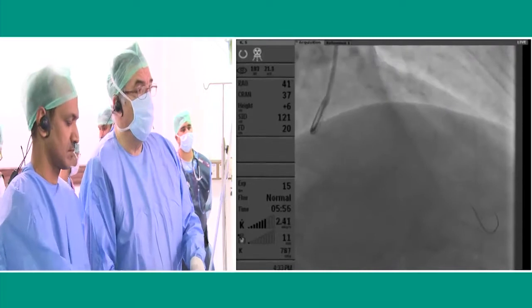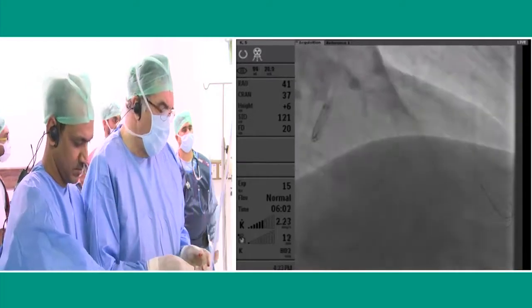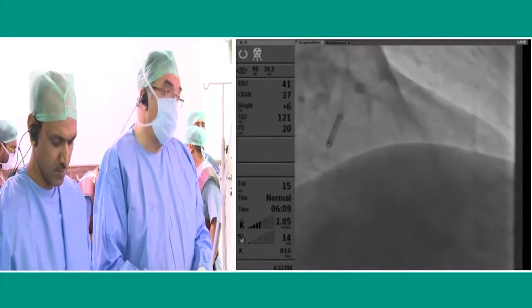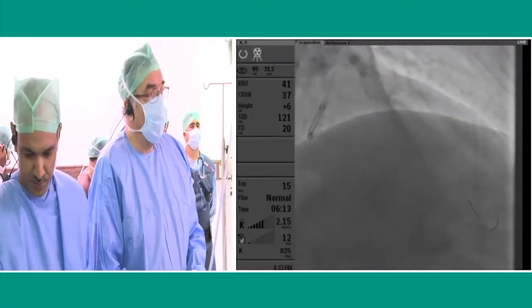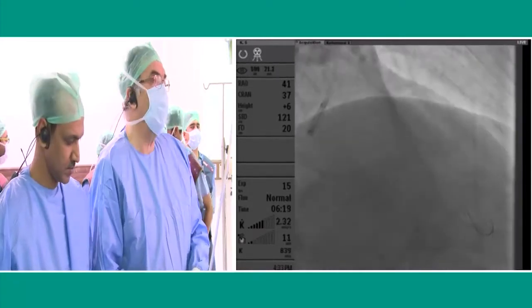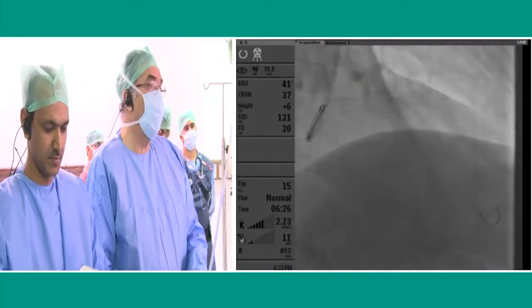There is a discrepancy between the proximal LAD and left main, maybe 3.0 and 4.5 in the left main. And as I know, there is an ongoing clinical trial on a dedicated stent for the left main, close to 5. Yeah, but with the last generation of stent, a 3.5 millimeter stent can go up to 4.5. So upsizing is not a major problem.